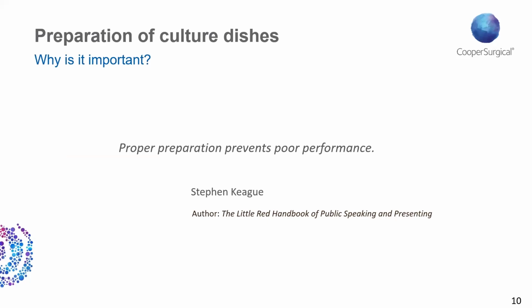But if you imagine nowadays, if we're thinking about uninterrupted culture, we're going to make a dish the day before an egg collection and potentially keep that dish in an incubator for 5, 6, 7 more days, then the dish itself and how you make it and the medium within it can have a profound effect on the outcome for the patients. And so attention to detail here is critical. So next slide, please.